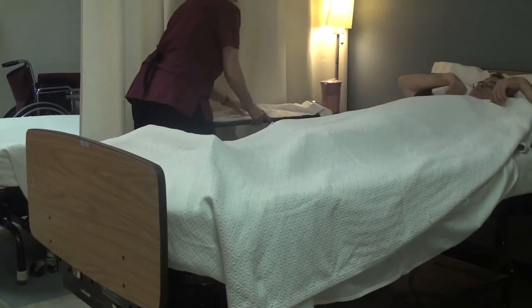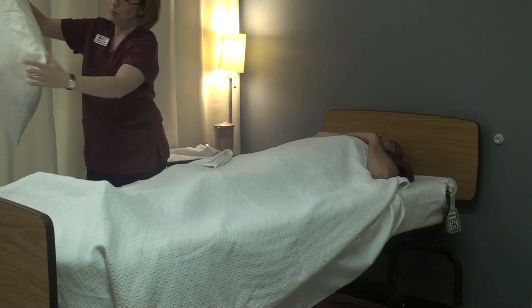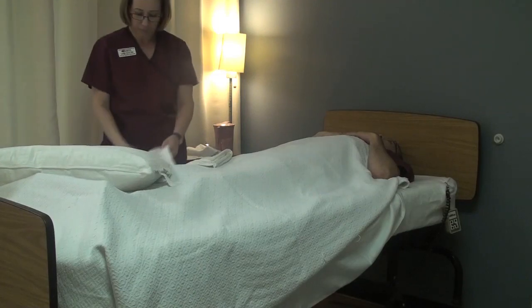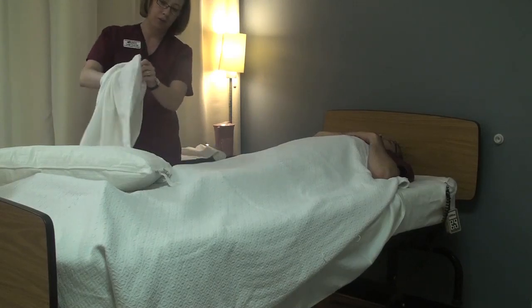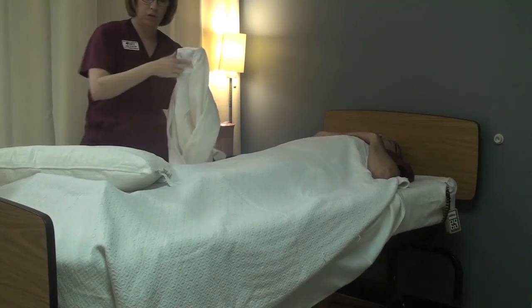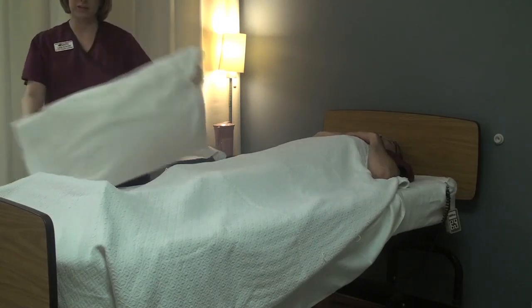Let's go ahead and get your pillowcase changed. I'm going to gently lift your head and take the pillowcase off, keeping it away from my body and uniform. I'm going to take the new pillowcase, reach inside, and find the corners. Then find the corner of the pillow and pull it down through. The tag always has to go on the inside of the pillow.